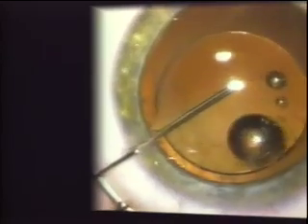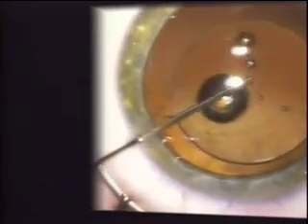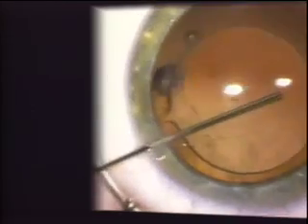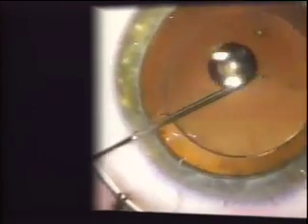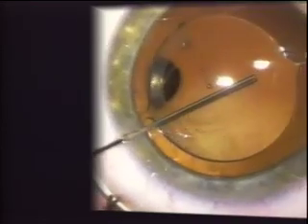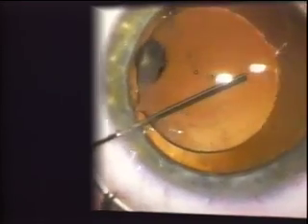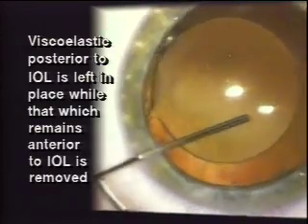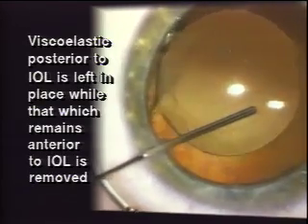Posterior capture of the IOL optic is performed after suturing of the scleral wound but before the viscoelastic is removed. Using a blunt cannula or a spatula, first one side and then the other of the IOL optic is slipped through the posterior capsulorhexis opening. The vaulting and ultimate capture of the IOL optic requires cautious manipulation because the posterior capsule is thin and may not have the same resistance to tearing as does the anterior CCC. Viscoelastic material behind the IOL is left in place while that which remains in the anterior chamber is slowly and carefully removed at the end of the procedure.